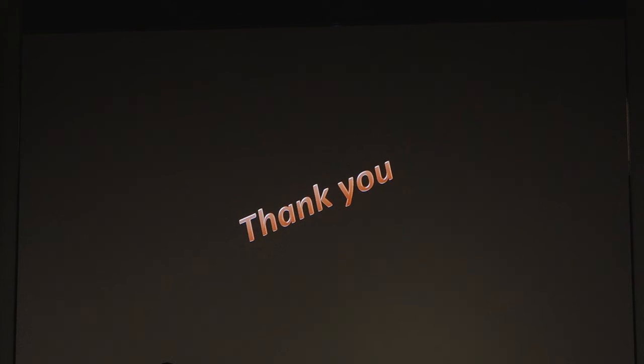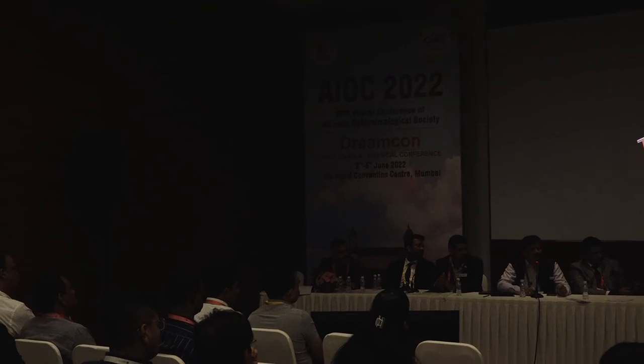Thank you. Yeah, one clinical point I would like to ask you, Sunil. I think most of us here are cataract surgeons. Once you implant the intraocular lens, you tend to see a stretch mark in the PC, a straight stretch mark. Sometimes this stretch mark really irritates the patient very much and they come with a lot of glare and halos. So when you'd like to do YAG, do you want to do it the very next day, or will you wait? Not definitely in the immediate post-operative period.